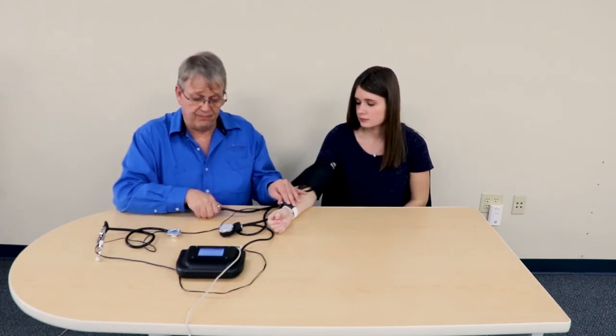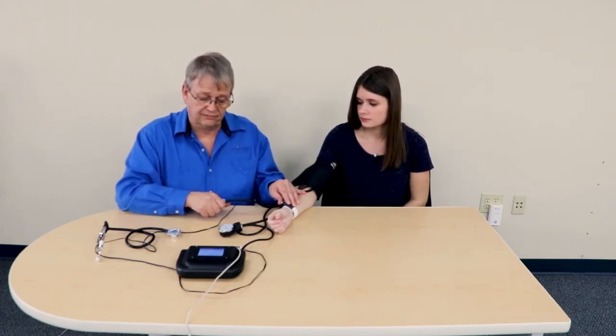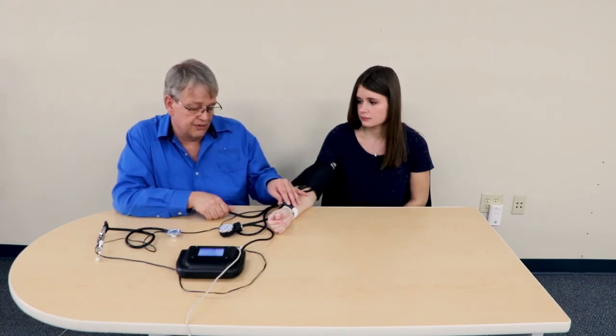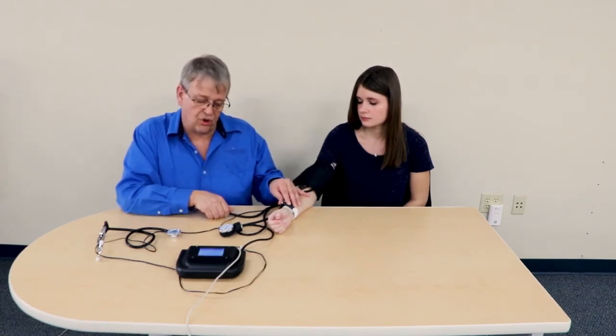Next I'd like to demonstrate Check Pressure 2 that we set up. I tap the next button — we're now on test 2. Same procedure: I pump it up until I no longer feel the pulse, so I know I'm above systolic. I start lowering the pressure, and I can feel the pulse and hear the Korotkoff I sound — that occurred at 120.